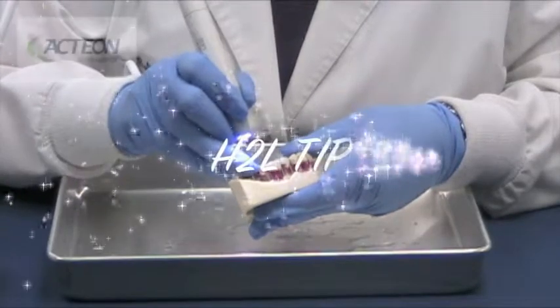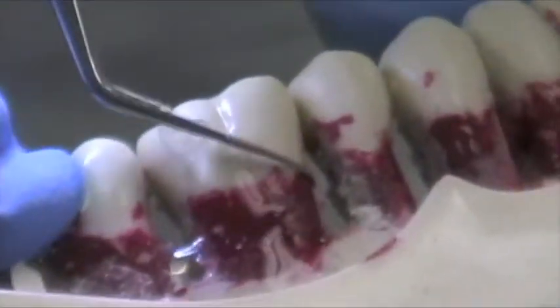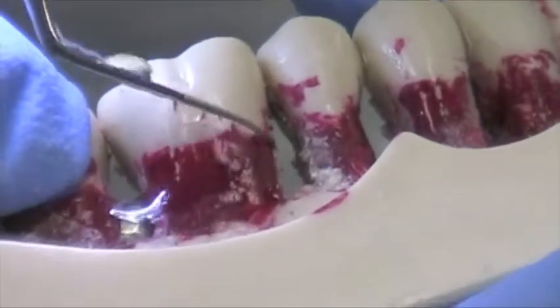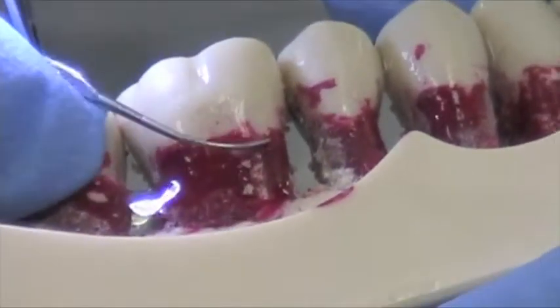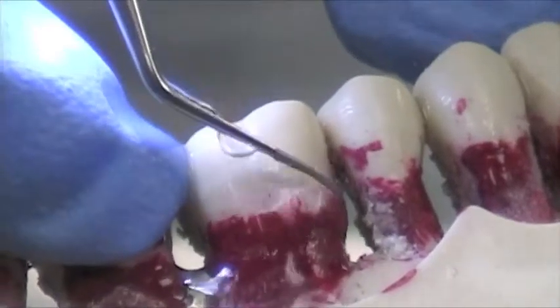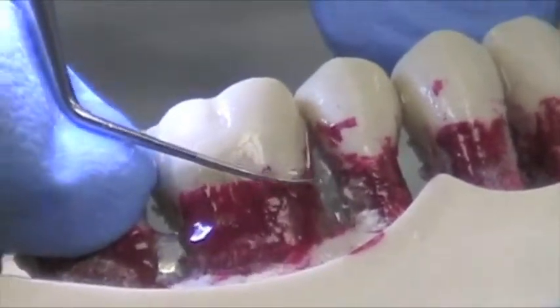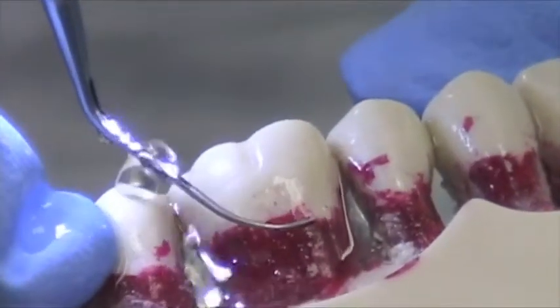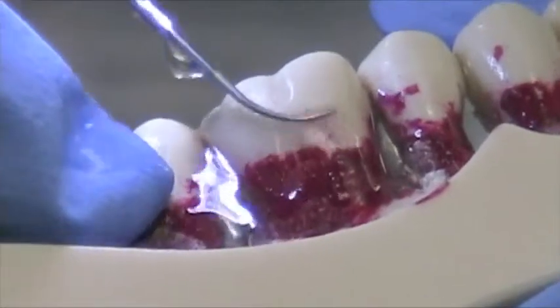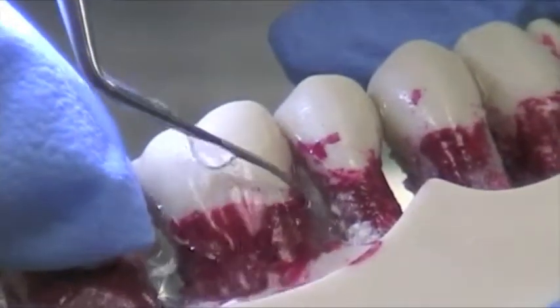Now we're going to demonstrate the H2L. The H2L is, again, a diamond coated tip — great for posterior areas. The H2L is going to clean the buccal surfaces as well as the mesial of posterior molars. Feather light touch. Even when you're in the green range, you can go down as far as one or two instead of being up on three. You can also turn the water very low so that you can actually see some of the cementum coming off.